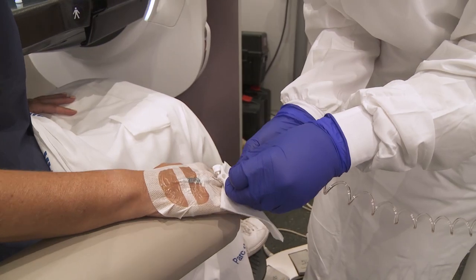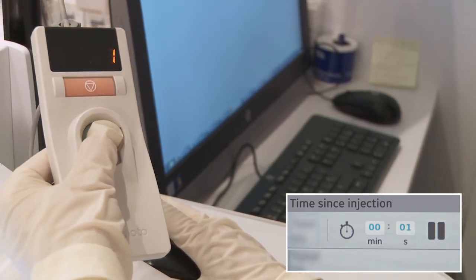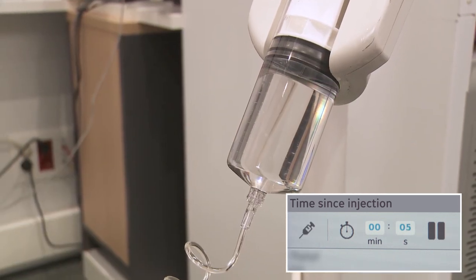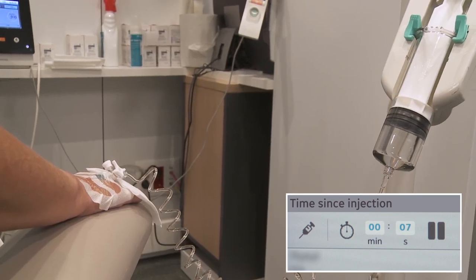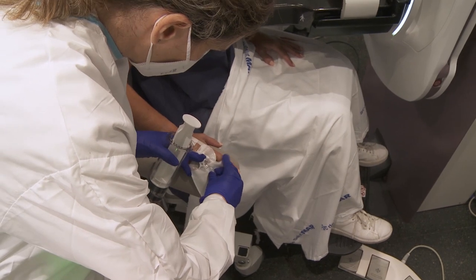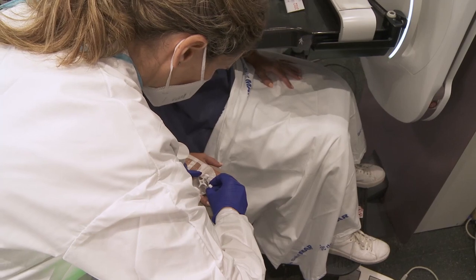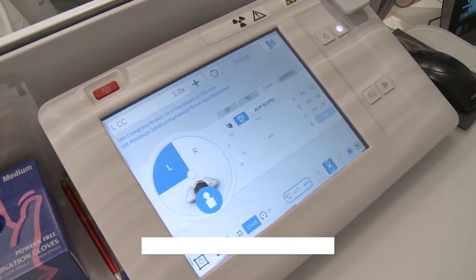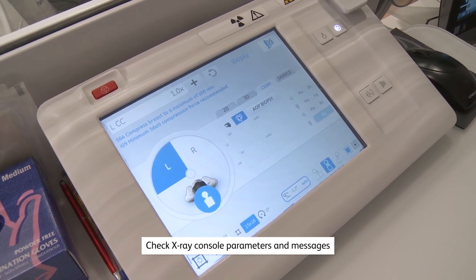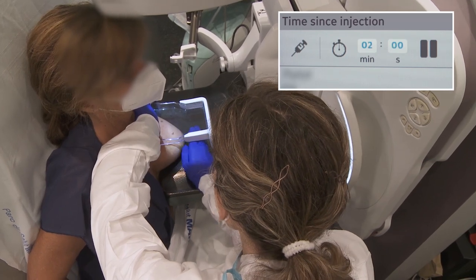Injection and on-screen chronometer are started at the same time. Position and compress the breast when time elapsed since injection start is close to 2 minutes.